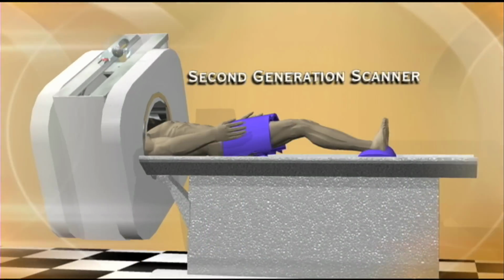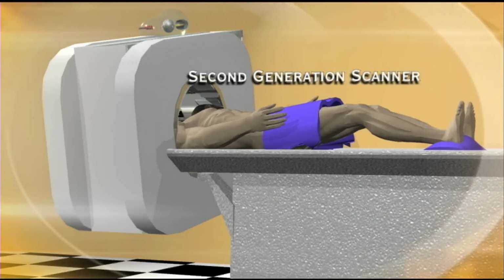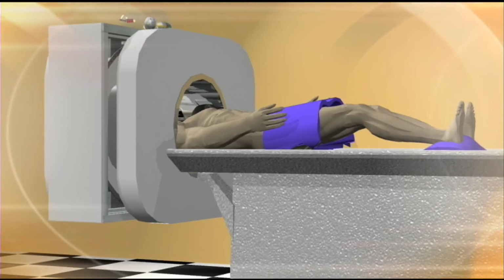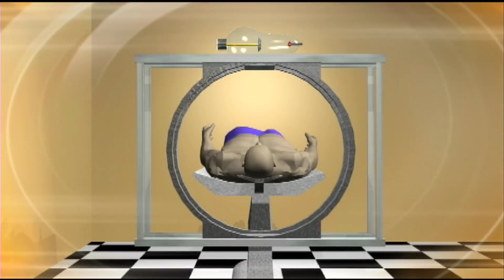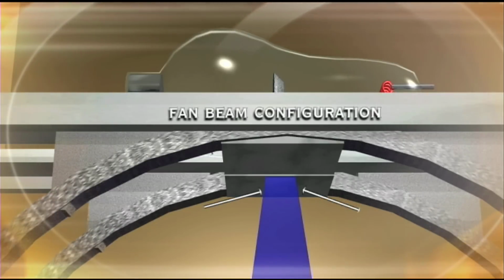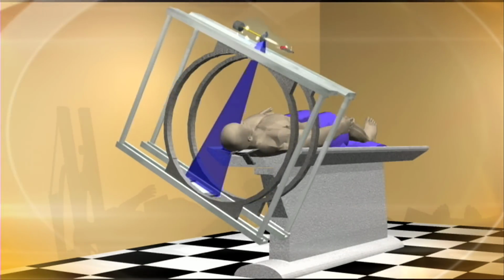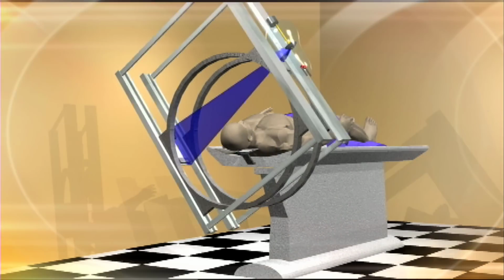The second generation scanners were very similar in operation to the first generation. You still had a rotate translate. The entire scanner moved back and forth and then rotated 1 degree. The configuration of the X-ray source changed from a pencil beam to a fan beam configuration. It spread out over the patient. And instead of having one detector on the other side, you actually had multiple detectors. Not a whole array, but maybe 2 or 3 or 4 detectors on the other side. And because of the increased number of detectors and the fan beam configuration, you could actually reduce the scanner time to a couple of minutes.